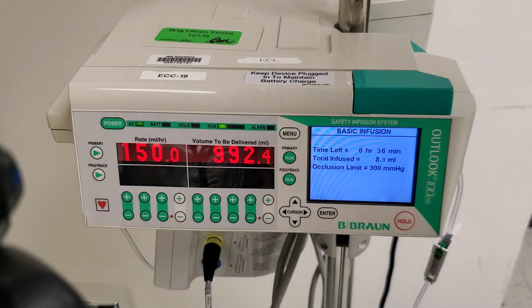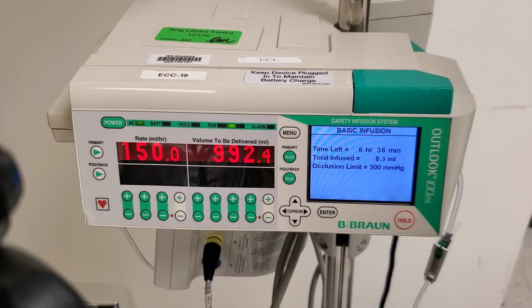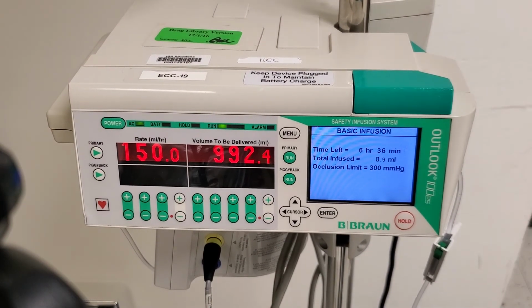Also remember, when you're delivering a piggyback, such as an antibiotic, you need to use the secondary extension set to drop your main fluid down lower so that the secondary fluid is higher and runs first. Any questions about these pump operations, you can reach out to one of your supervisors and they'll be able to answer your questions.